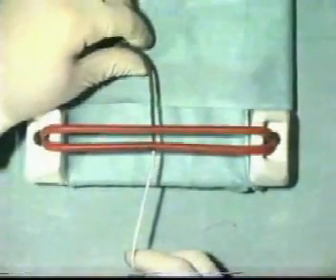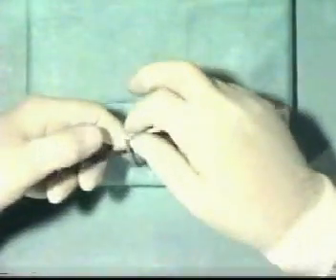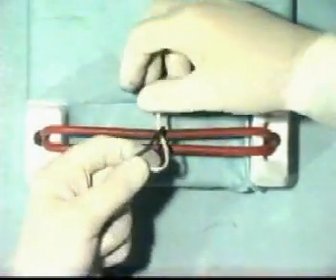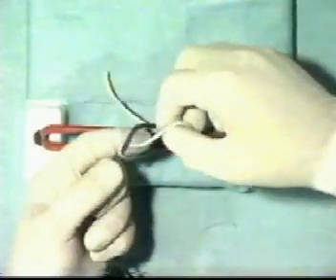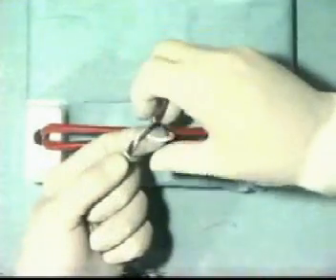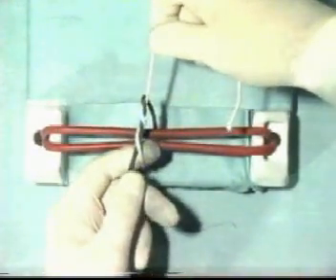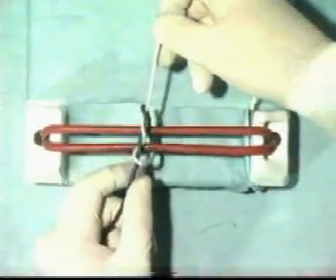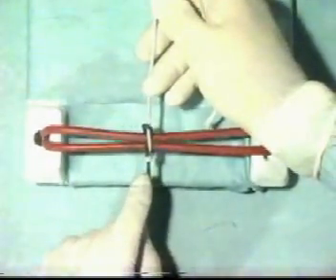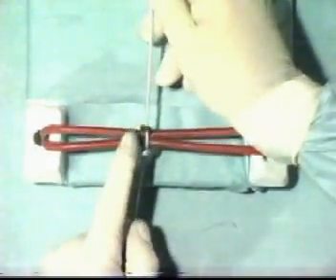Let's tie this now once more in slow motion. Take the threads and cast the first throw of the reef knot, and then take the thread through once more. Then, you're in a position to snug down that first throw of a surgeon's knot, and as you do so, ensure that it lies correctly. Tighten that first throw appropriately.